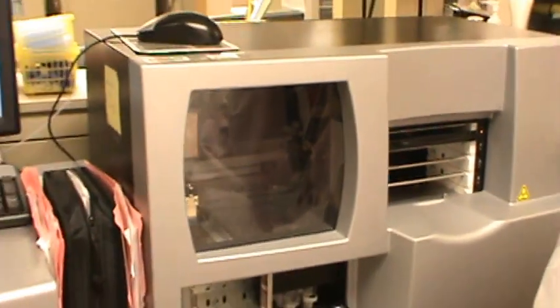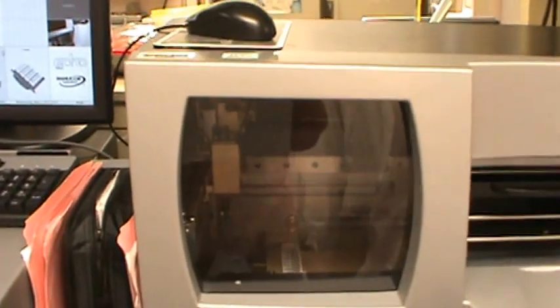If you take a look at our probe, he is sampling. Now he's washing in the wash bay. You have to excuse the saline. And he's going down into his reagents.